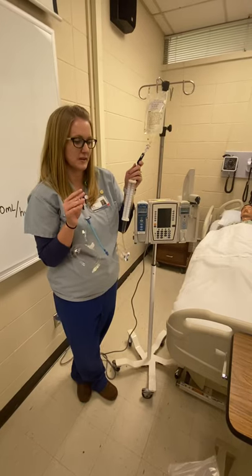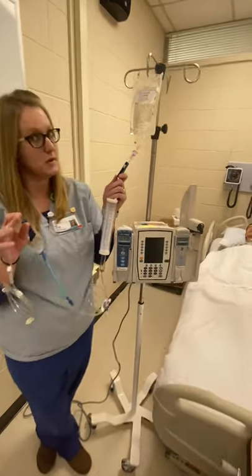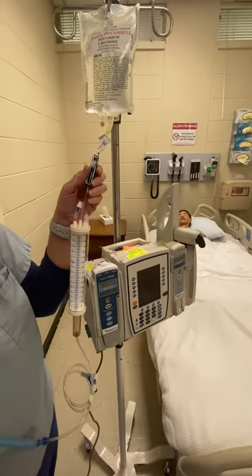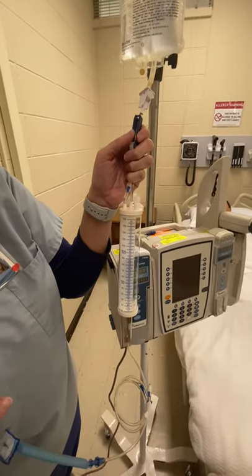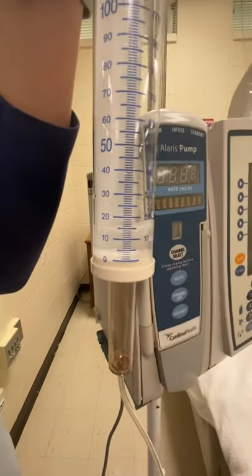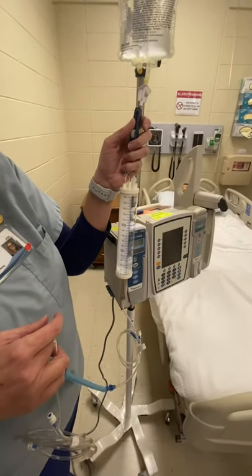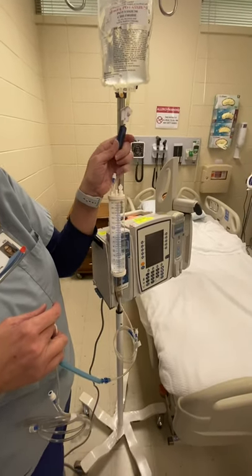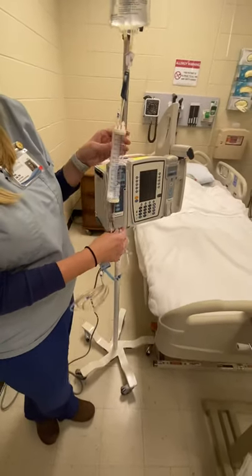To prime this buretrol, it takes about 20 mils. You want to put more than 20 in there because if not, you're going to inevitably get air in your line. Open your roller clamp until you get to about 25 or 30. There's no magic number — you just want to give yourself a little bit extra so that as you're priming, you don't get air in your line. Once you've gotten enough fluid in there, turn that roller clamp back off and let's start the priming process.